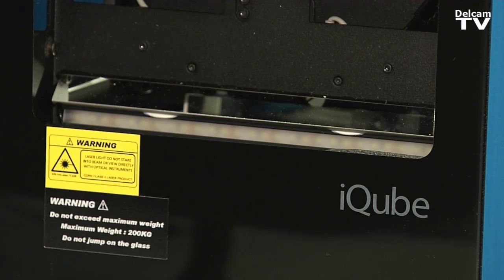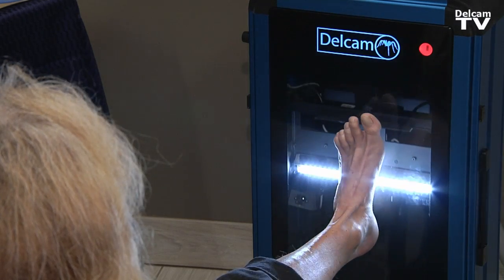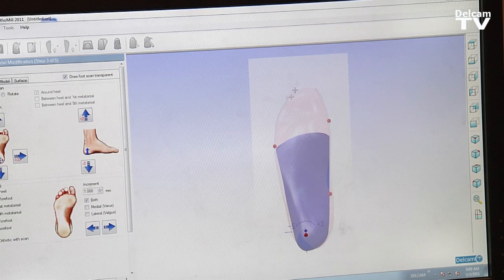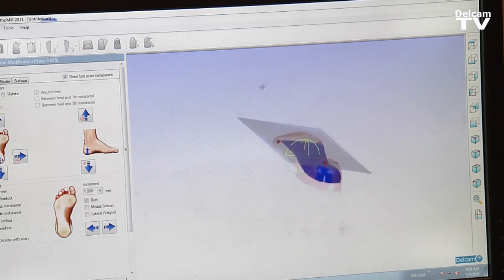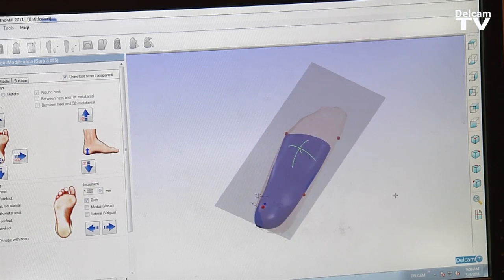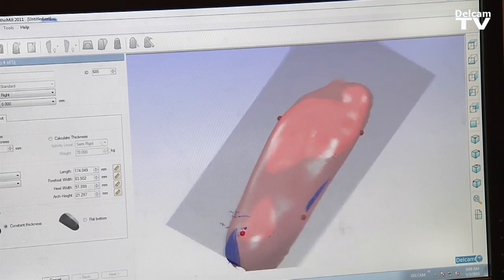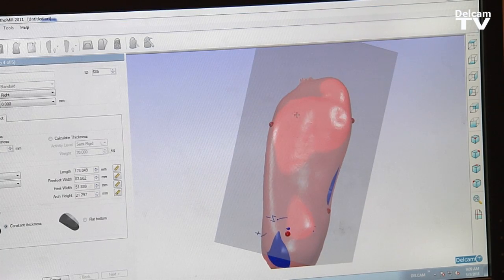The iCube captures a better image of whatever it is that you want to reproduce. In order to capture the foot properly, you've got to have three axes. The DelCam scanner catches the Z-axis, which is the most important, because that's the third dimension that helps create the final product from the OrthoMill program.